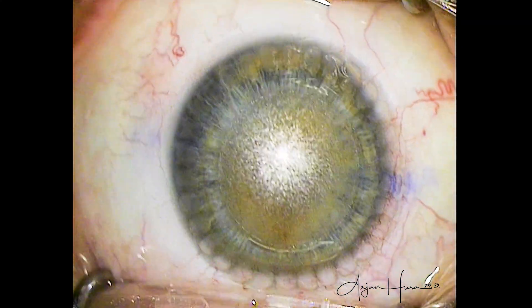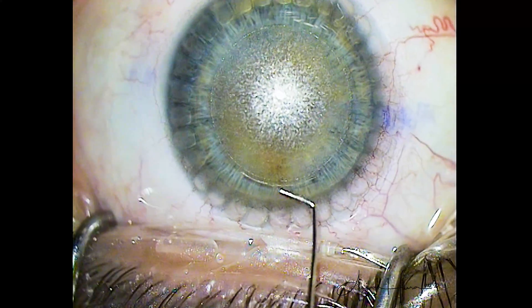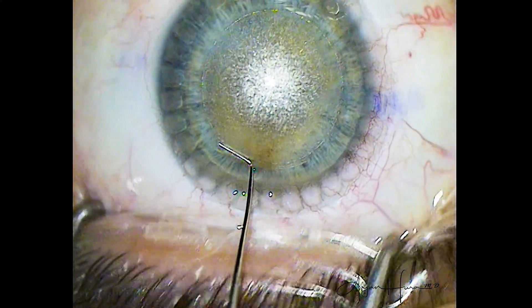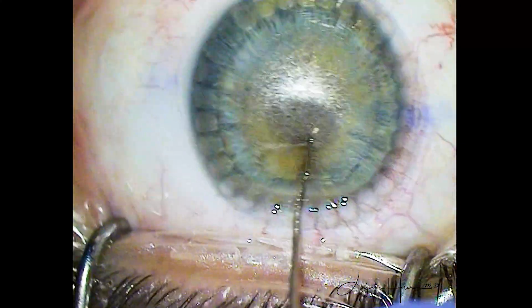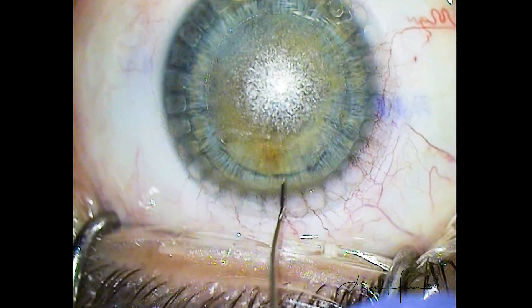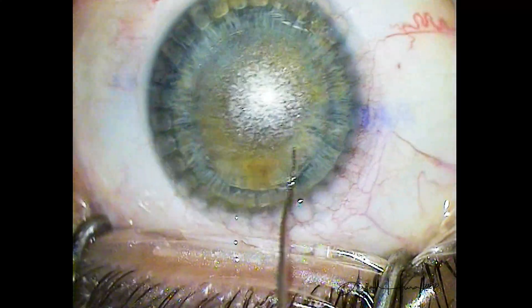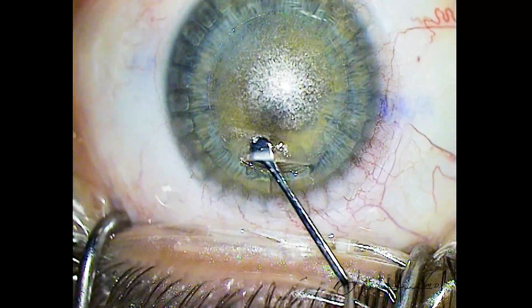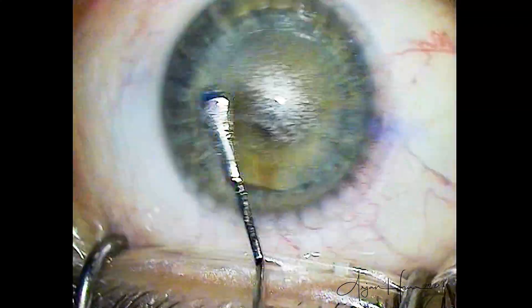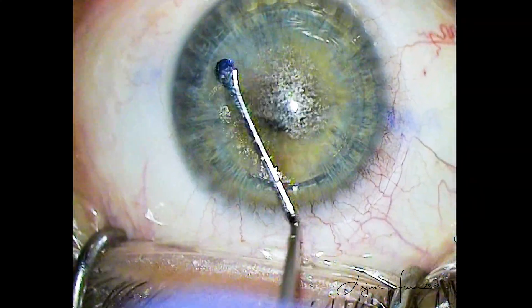Here, we're just putting a little BSS on the cornea, and you're going to see me center the laser in our field of view. I will take the SMILE dissector, open up the SMILE incision, and tip the instrument anteriorly to define the anterior plane. Now I go posteriorly to create the posterior pocket, and as I move the instrument back, I notice it goes past midline with no resistance, which tells me I'm still in the anterior plane. So I go again posteriorly — a little more resistance, that feels right — and there's the hard stop. Now I know I've defined the anterior and posterior planes, so it is safe to proceed. I insert the dissector at an angle, using the air bubbles created by the Visumax laser to confirm I'm in the anterior plane, and I'm gently doing a 360-degree dissection of the anterior plane.